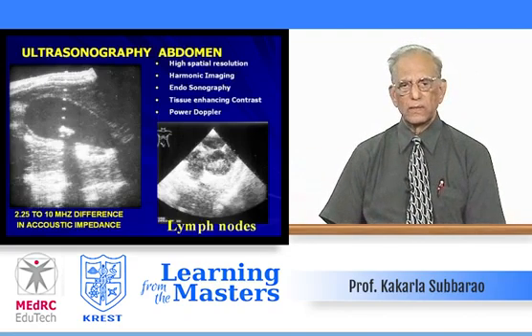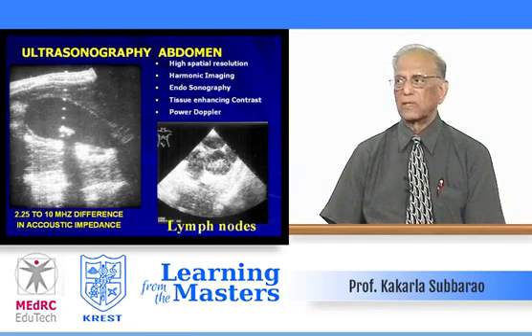Ultrasonography today, I said nobody does cholecystography. It's forgotten because it's time consuming, contrast media reactions, X-ray exposure. So ultrasonography is the simplest, easiest.